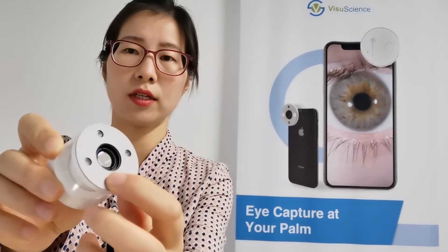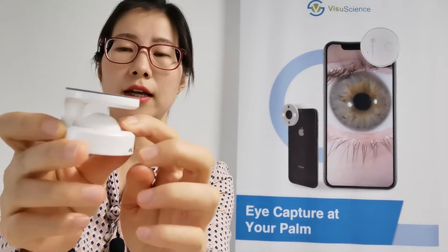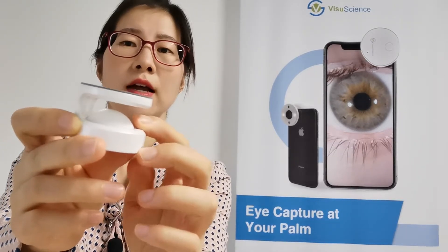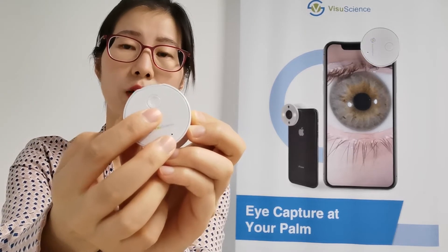Let's check the structure of this device first. Here you can see a 15x magnification lens with coating, and here are four LED bulbs for illumination. Here is an air cushion to enable it to fit on different smartphones, and the back side has a power switch to control the illumination.